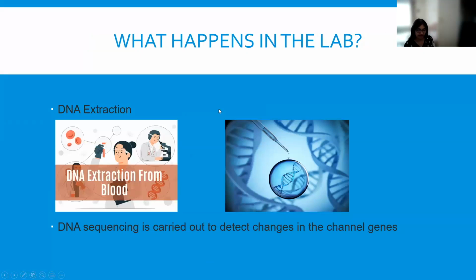So when the patient comes to clinic, a blood sample is taken for genetic testing and sent to our lab. Our neurogenetics and the Great Ormond Street Hospital lab team are based in the same building. The technical team do the practical laboratory work, and we as scientists analyse the data and report the results.